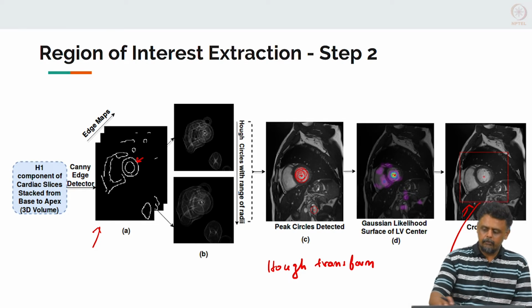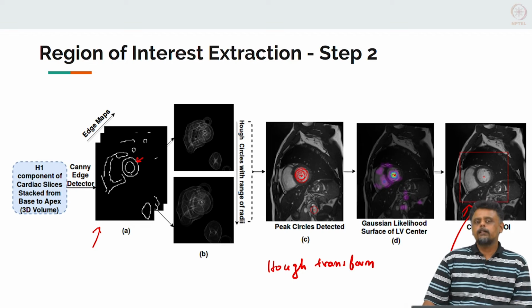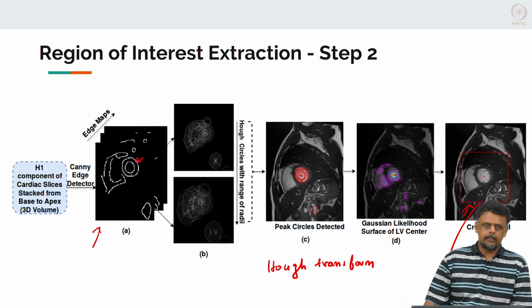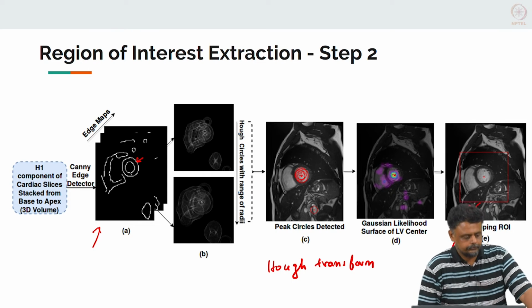So, what we have done by doing this cropping is to make the problem very simple, in the sense that the CNN now does not actually have to localize the heart. We know we are only giving it the beating heart as input, so the edges etc. would be the ones to focus on. Again, if you do not want to do any of this, that is also fine, you can take the entire image and give that as input to the CNN.